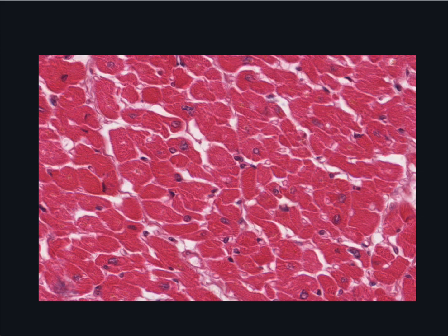Now, the main and thickest layer is the myocardium, which corresponds to the tunica media of an artery. It is a thick band of darkly staining cardiac muscle cells, or cardiomyocytes. You may be able to see that cardiac muscle of the myocardium is sectioned in various orientations, but mostly transversely in this section stained with hematoxylin and eosin. Note how irregular the individual muscle cells are in size and shape. This is in part because cardiac muscle cells branch.